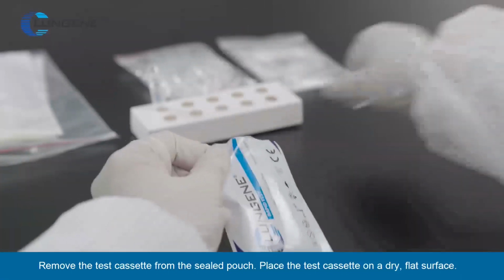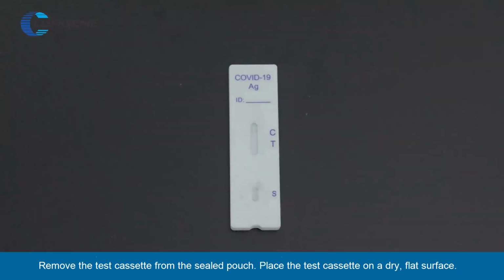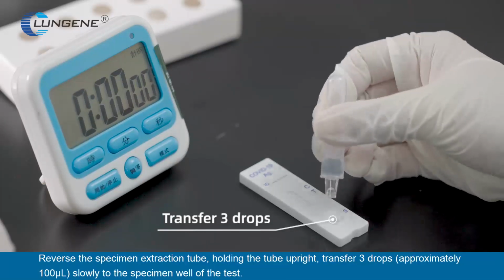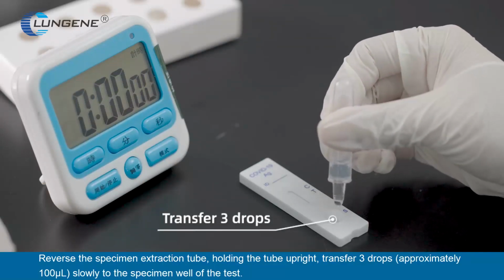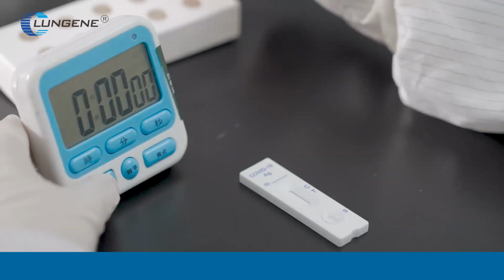Remove the test cassette from the sealed pouch. Place the test cassette on a dry, flat surface. Reverse the specimen extraction tube, holding the tube upright. Transfer 3 drops, approximately 100 microliters, slowly to the specimen well of the test.